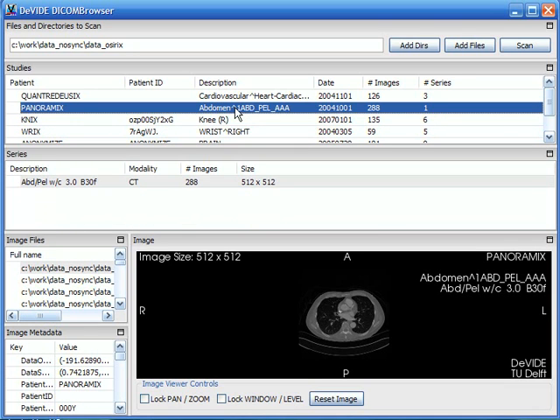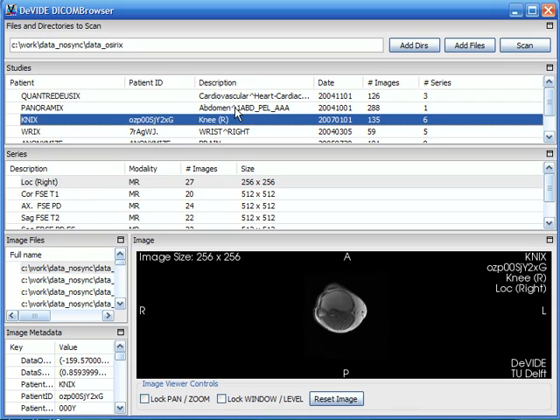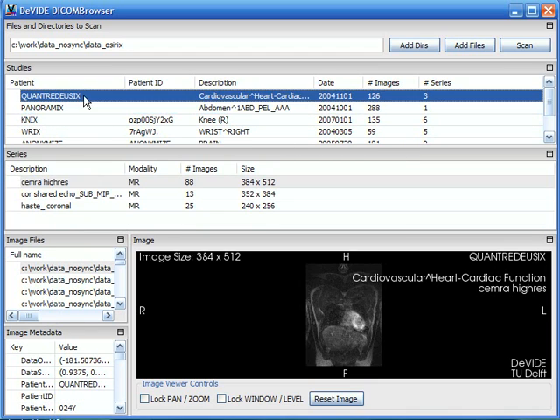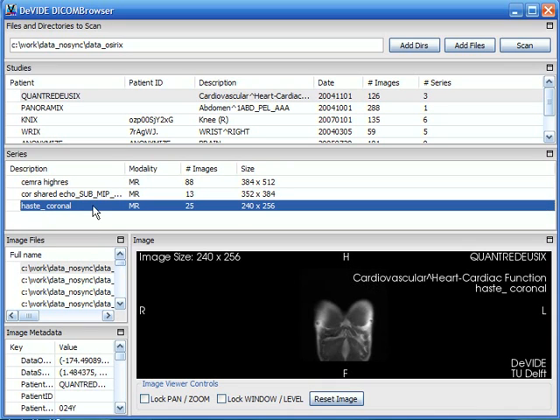So here you can see I'm scrolling through different studies. Each study is associated to a specific patient and one can see all the metadata over here study-wide and when I select a study I see the series which are part of that study.